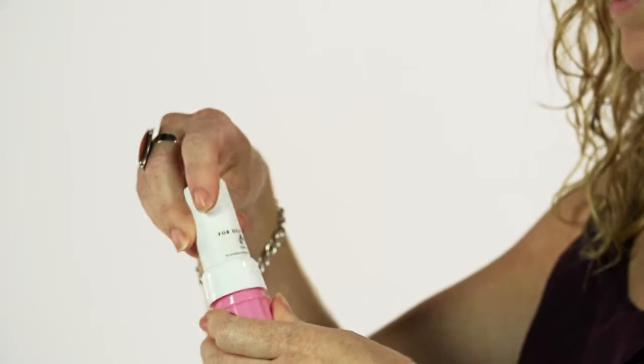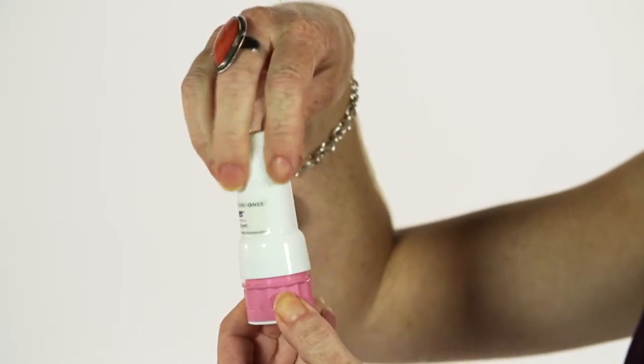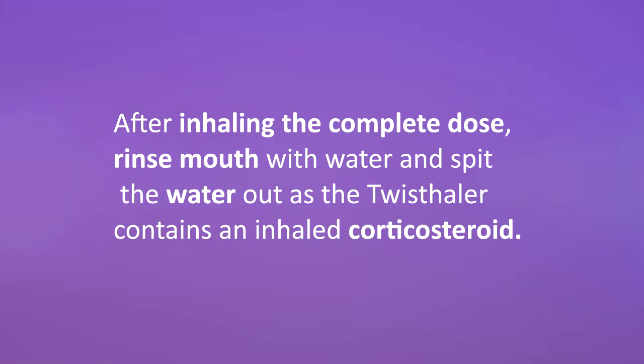If a second dose is needed, it is very important to replace the cap and twist it closed. By opening the cap again, the second dose is ready to be inhaled. Exhale away from the device and repeat the remainder of the steps. After inhaling the complete dose, rinse mouth with water and spit the water out, as the Twisthaler contains an inhaled corticosteroid.